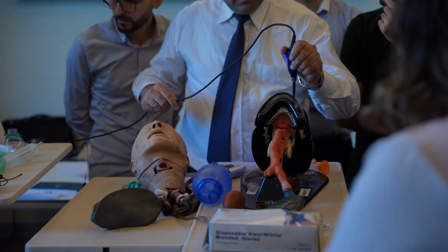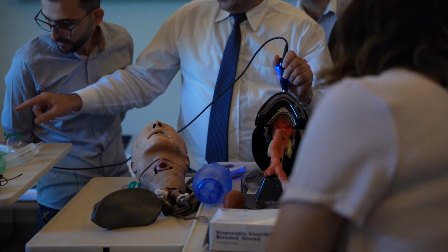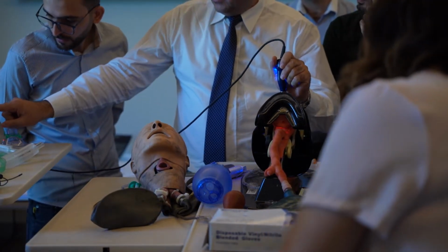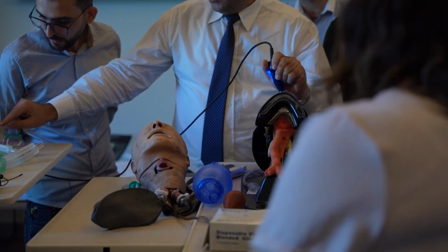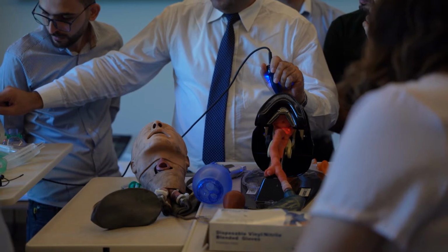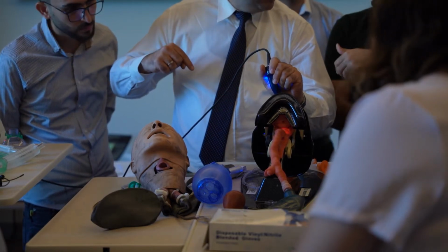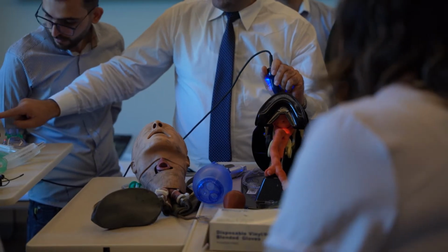So this is the tongue. And this is the epiglottis. After the tongue, this is the base of tongue. This is the epiglottis. Where we should put the laryngoscope blade should be above the epiglottis, not below. Why not below? Below is the esophagus. No, not below the epiglottis, I mean.